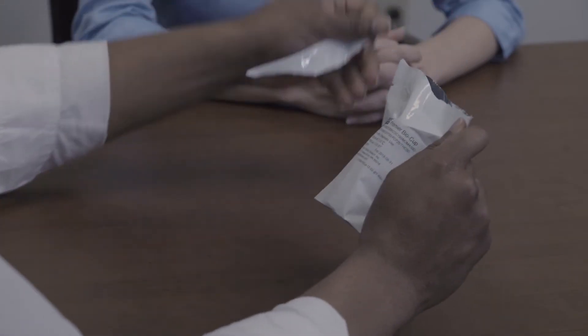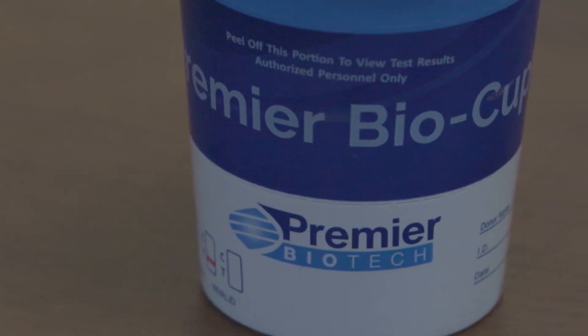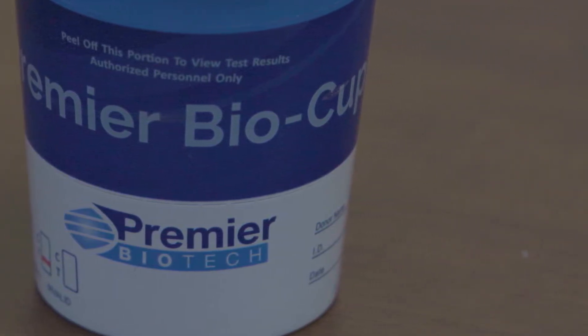Remove the cup from the foil pouch. There is no minimum fill line on the Premiere BioCup. Next, remove the lid from the cup and have the donor supply the specimen. It is recommended to collect enough specimen to run the temperature strip.